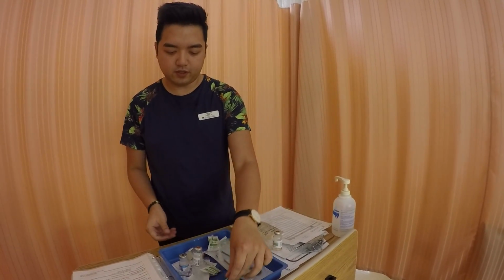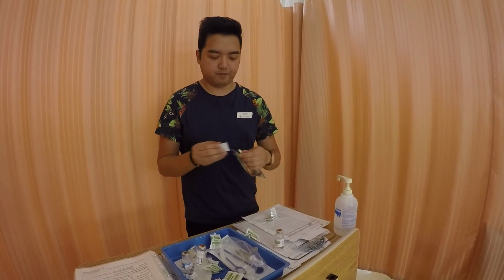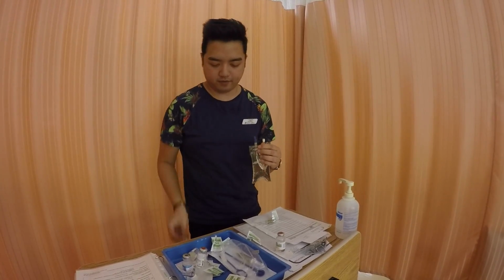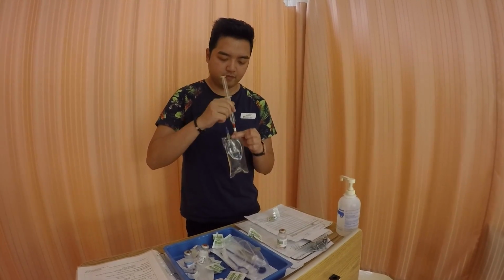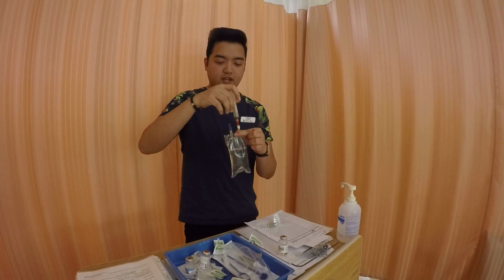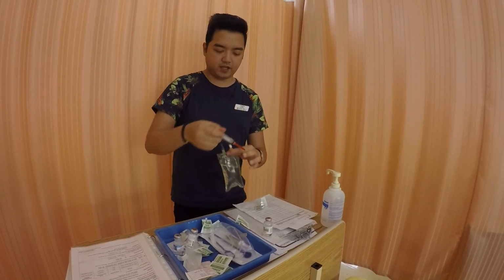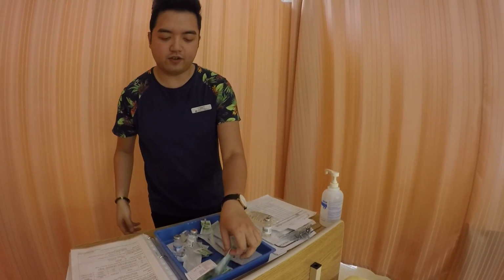And the next thing we need to do is to swab the end of the secondary bag for 30 seconds, let it dry for 15 again. Inject the 10 ml of medication. Okay, so now we have 10 ml in there. We just need to get the remaining 5.8.